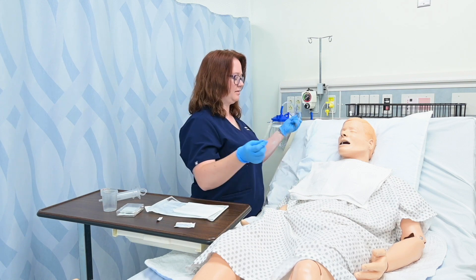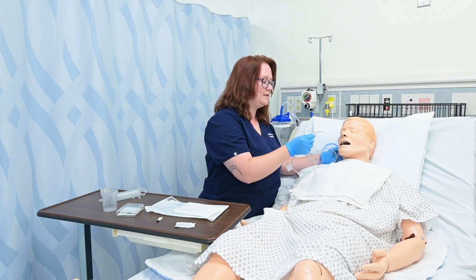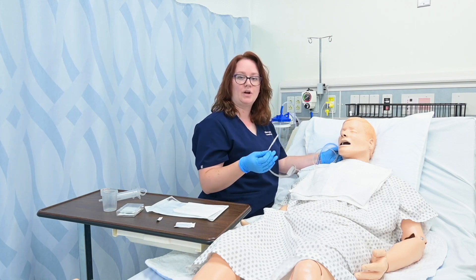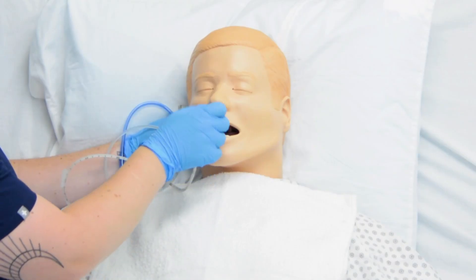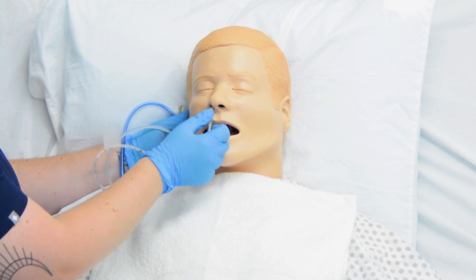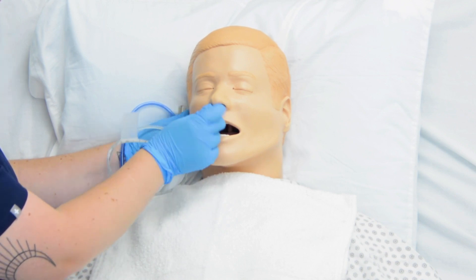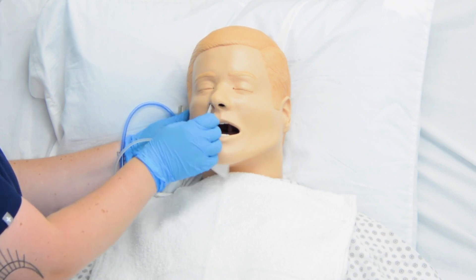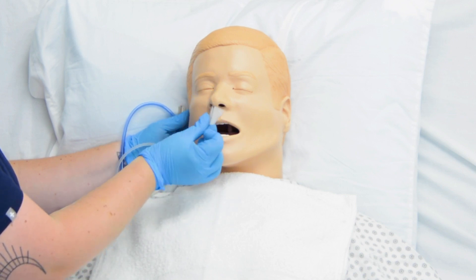Once I'm ready, I'll go ahead and ask my patient to flex their neck up a little bit. I'm going to insert it into the nare. If I meet extreme resistance I need to stop, withdraw, and either try again or try the other nare — I don't want to push past extreme resistance. To help facilitate it into the esophagus rather than elsewhere, I can encourage them to swallow. If they're oriented and capable, I can give them a glass of water and have them take small sips, telling them to swallow. You can see I've made it to my tape.